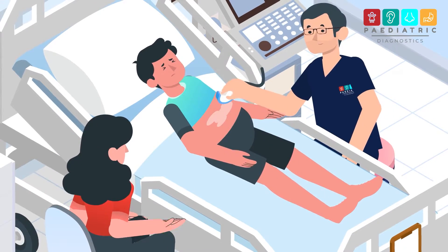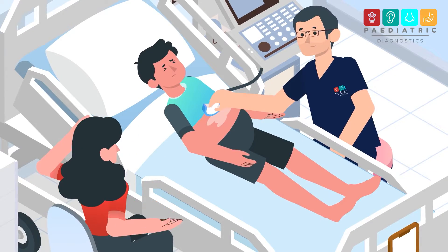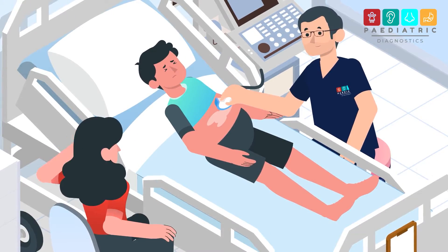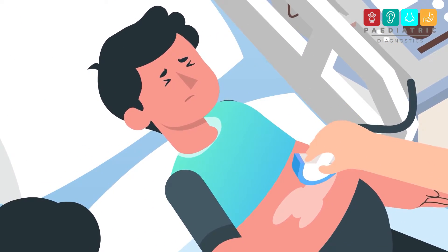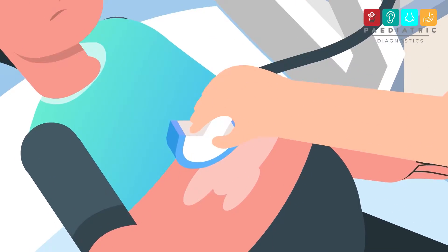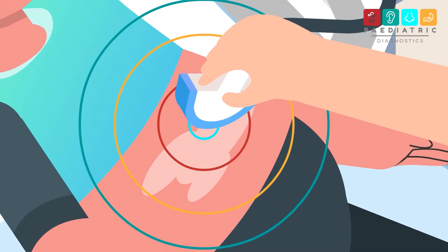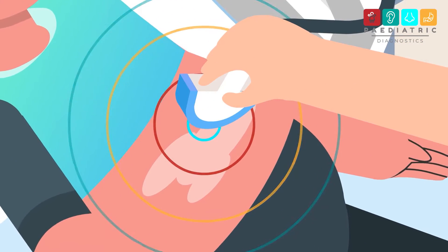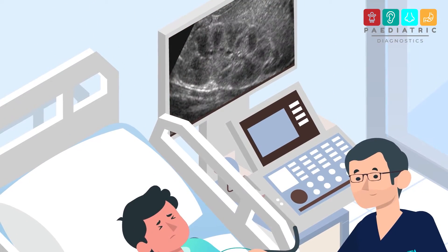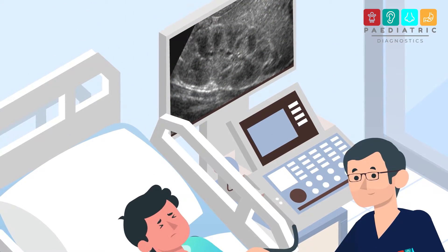Then, using a small handheld device called an ultrasound probe, the doctor will gently move it over your child's tummy. The probe sends harmless sound waves into your child's body, and these sound waves bounce back to create detailed images of their organs.